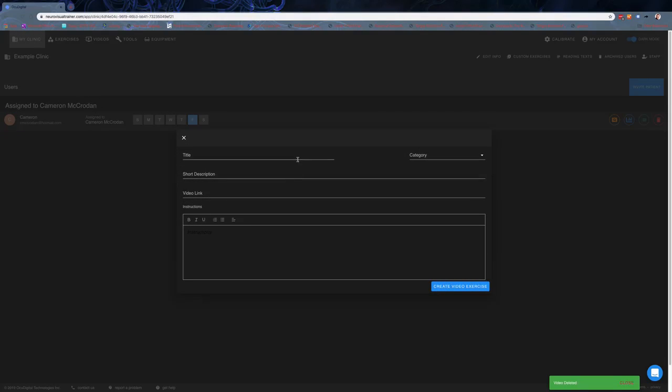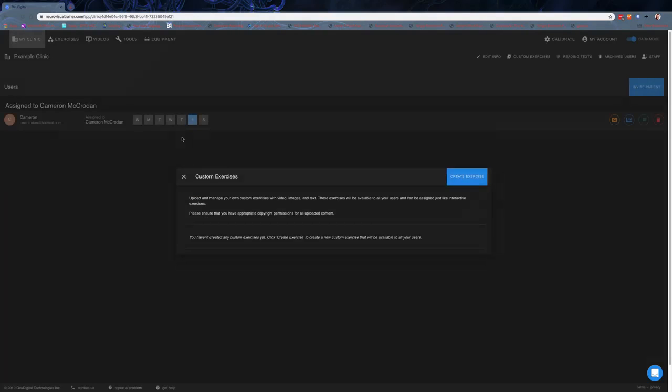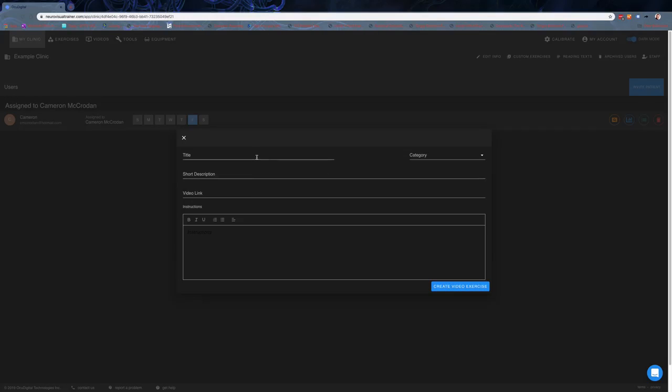When you're asked to create the exercise, you get to put in the title, assign it to a category, put in a short description, and a video link. I am aware the team is working on getting it so the videos are all hosted and uploaded internally, but for right now what's been recommended is to do it on a private YouTube or Vimeo channel so it's not searchable from the outside. You can put the link in there for your patients and staff, and then put the instructions down below. When you click create, it'll create that exercise.